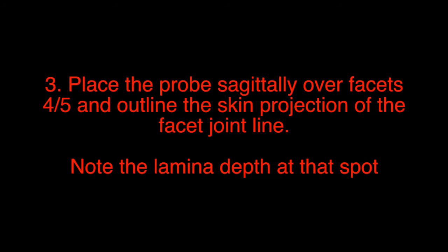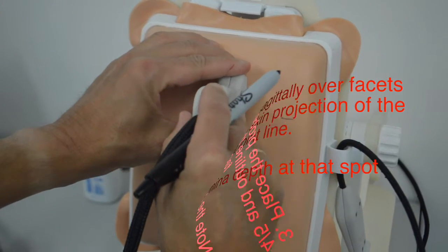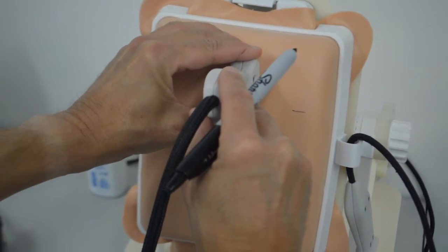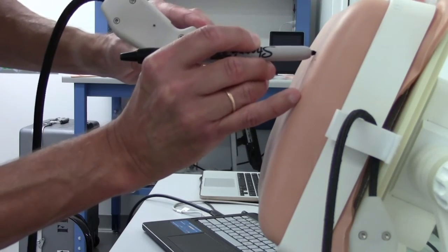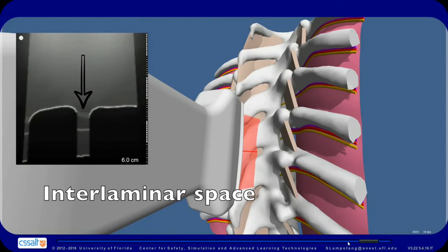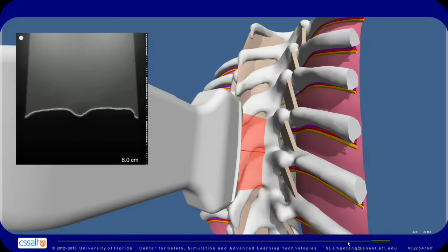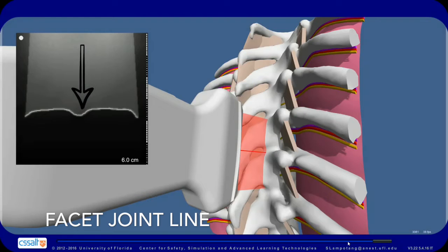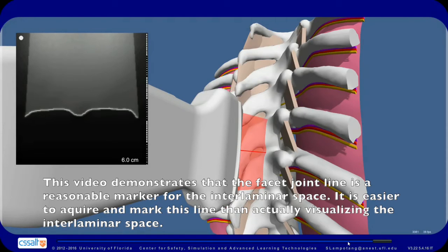Step 3: Place the probe sagittally over facets 4 and 5 and outline the skin projection of the facet joint line. Note the lamina depth at that spot. We use the facet joint line as a surrogate marker for the horizontal level of the interlaminar space. The facet joint line is a reasonable marker for the interlaminar space, and it is easier to acquire and mark this line than to actually visualize the interlaminar space.